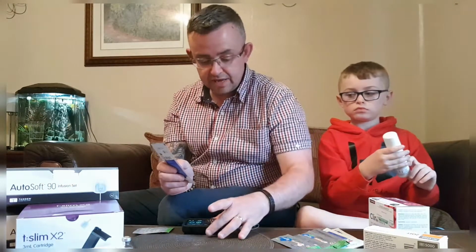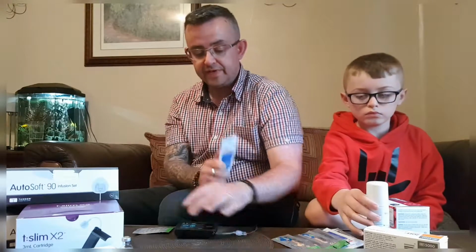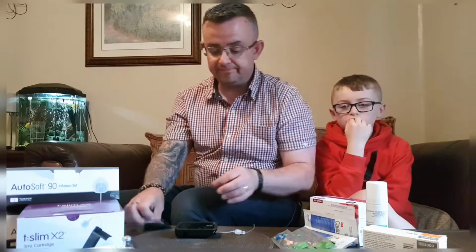So my pump's now telling me that I'm low on insulin, that I've only got 21 units left, and that's an alarm I've set up on there. So yeah, that's another one, Cavilon, but we're not going to be using that one today.